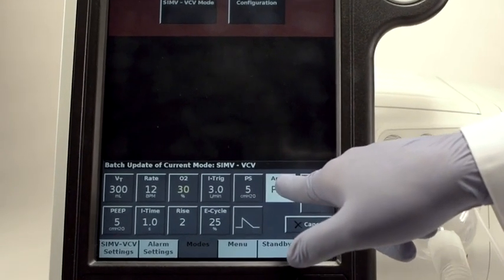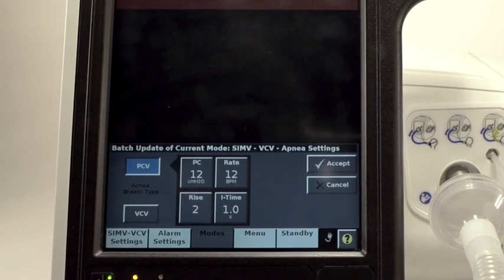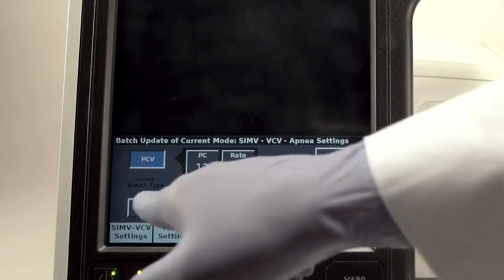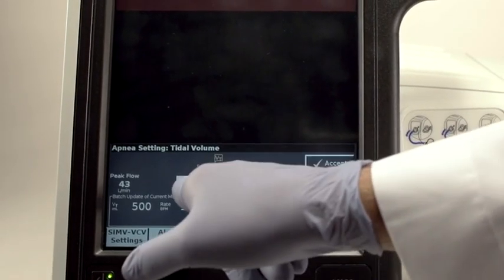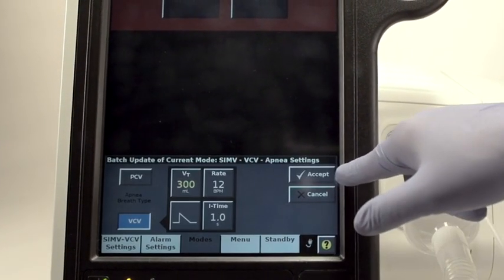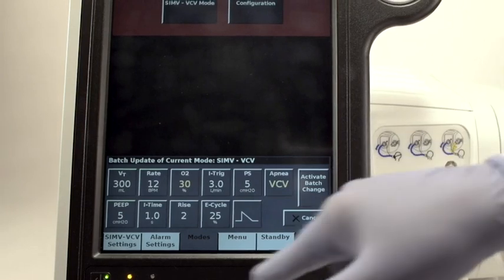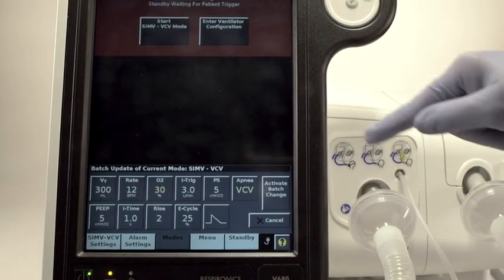Touch the APNEA button to access the controls for APNEA Backup Ventilation. APNEA Backup is available as either Pressure Control or Volume Control and has its own settings, independent of the main mode ventilating parameters. Let's set the APNEA Ventilation to Volume Control and the Tidal Volume to 300 as well. The APNEA Delay Time is found in the Alarm Settings window.